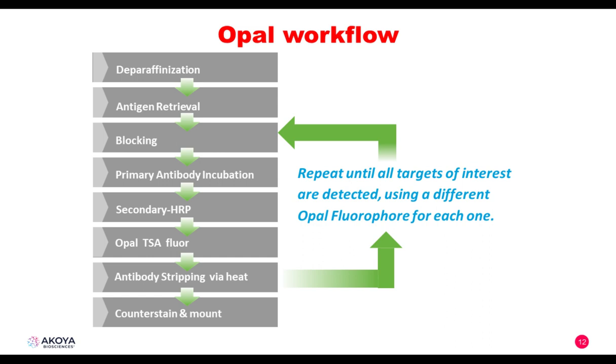strip. Once the stripping is completed, we can repeat that process and start for the next antibody. We can do that up to 8 times, and then add DAPI and mount.